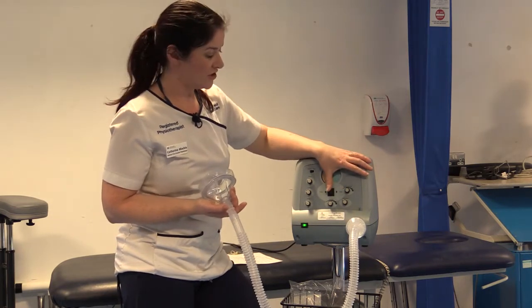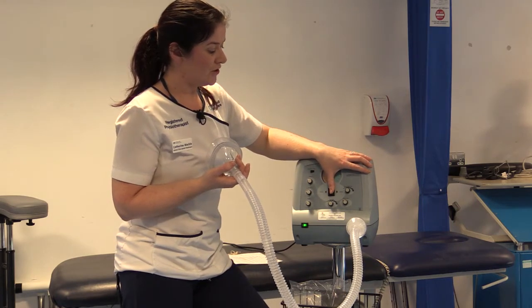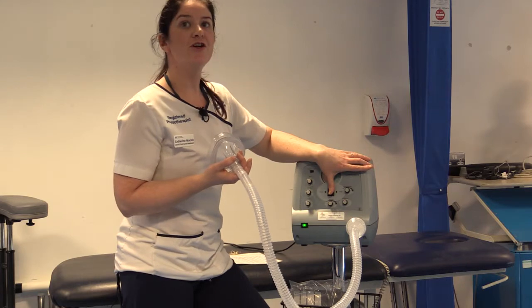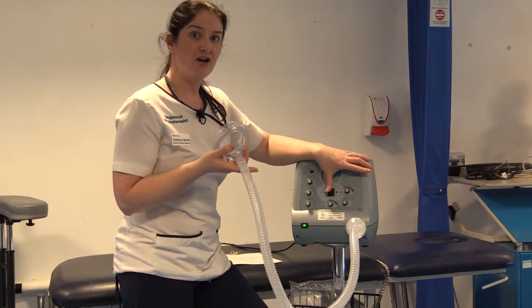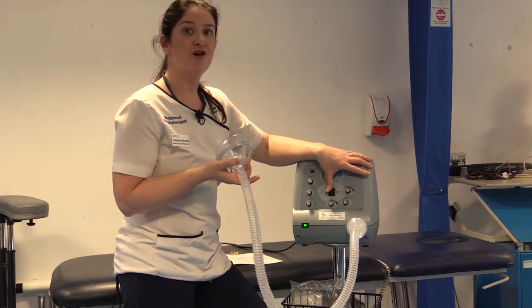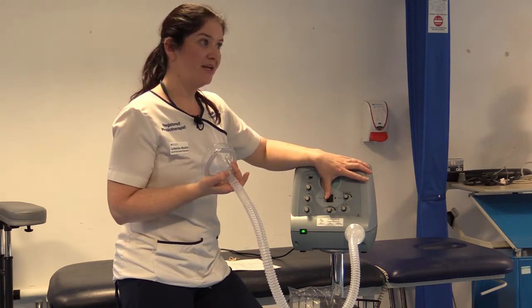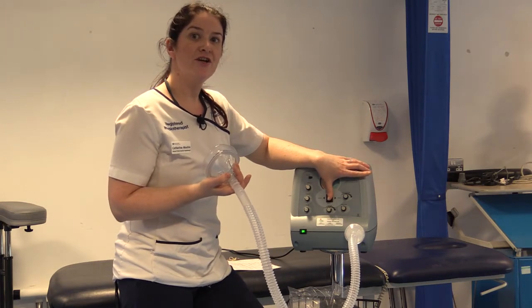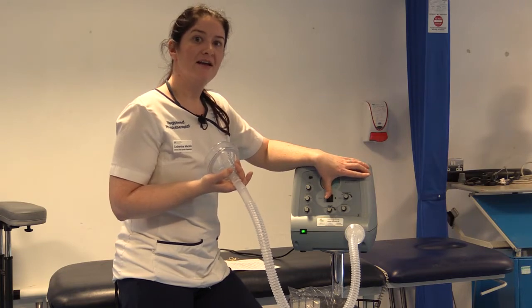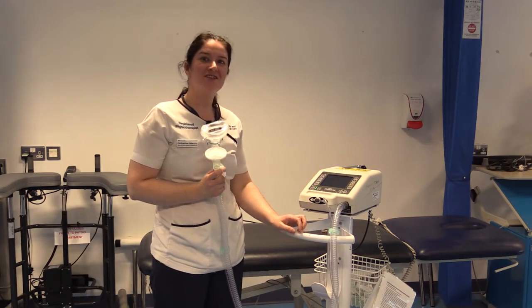You may want to do three inhalations, flicking over in — two, three, out — two, three. Your commands could be: in two three, out two three, pause. You could do four to six breaths depending on the patient — that would be one cycle. When you've finished four to six cycles, you want to finish off with one or two insufflations: in two three, in two three.